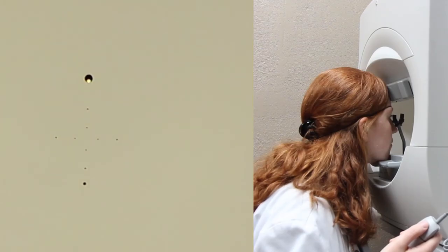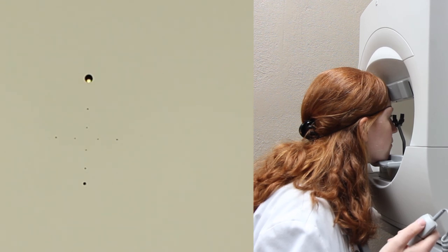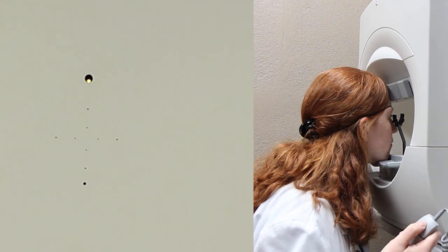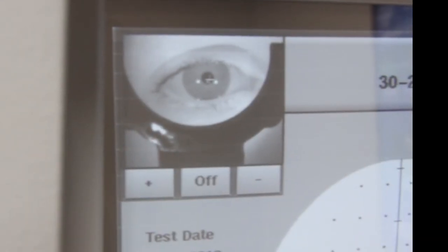Quickly click this button every time you see a small, round, white flash of light while keeping your eye on the fixation light. Do not look at the white light.